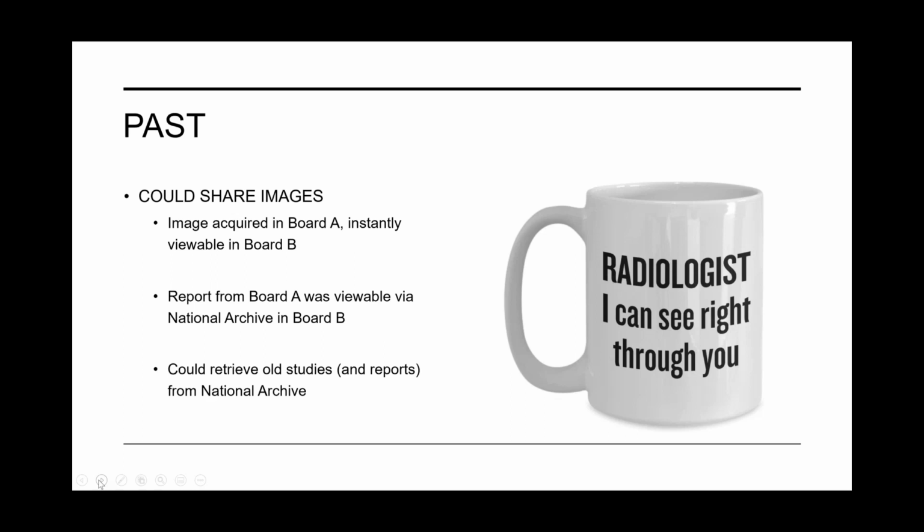But with radiology, it's also the report. So we ended up getting the facility to have reports done in board A, and they would also be viewable in board B, assuming that report had been done, and that was via the National Archive. The National Archive was where we could store all old historical studies and also the reports, principally from about 2010.